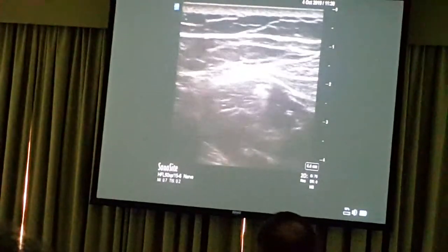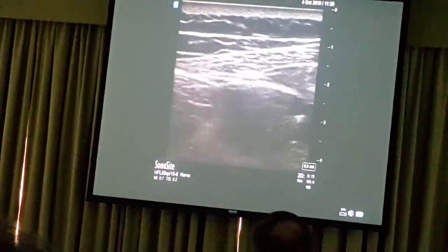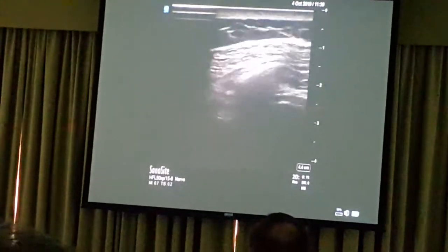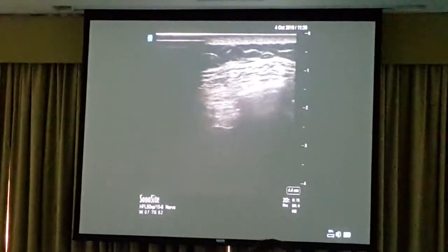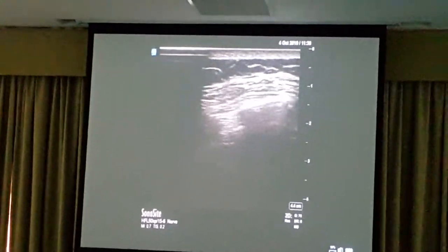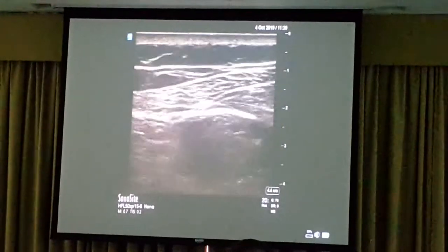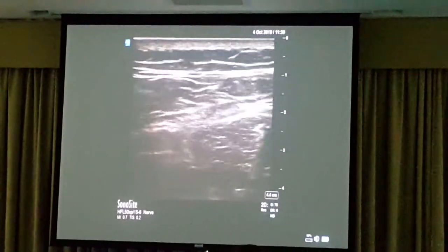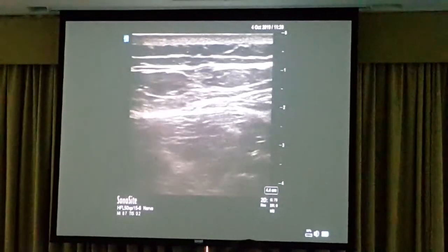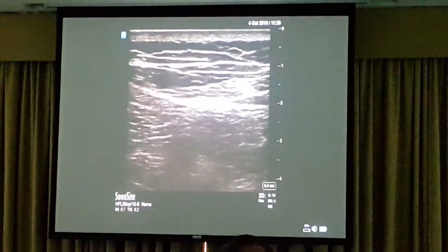Now, if I track this muscle in the middle, oblique, if I track it up, it gets bigger and bigger and bigger. That muscle goes all the way to the ribs. That's latissimus dorsi. So if I go back down again, down, down, until it's gone, okay, latissimus dorsi, internal oblique, quadratus lumborum, erector spinae in the back.